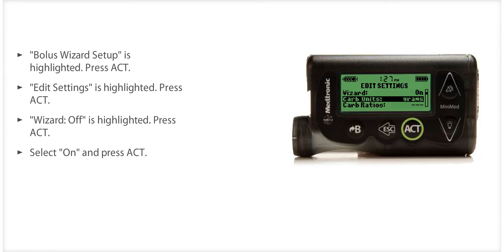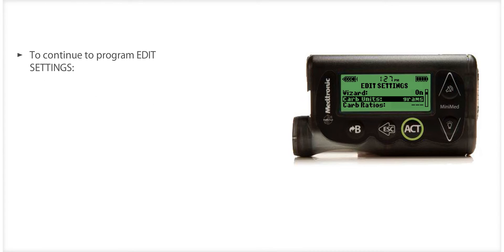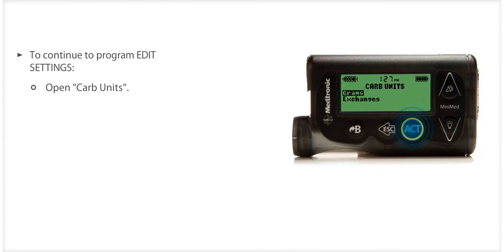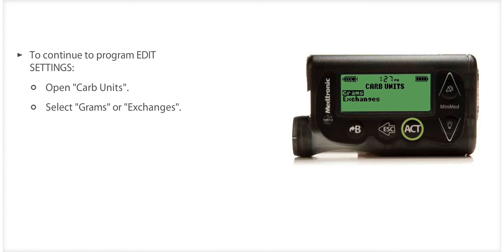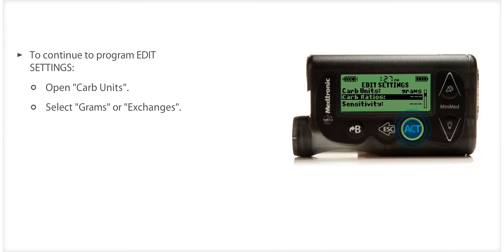The Edit Settings screen will be displayed with CARB Units highlighted. Press ACT to open the CARB Units menu. Choose the method you want to use to count your carbohydrates — in grams or exchanges. For this example, we'll select grams. Press ACT.